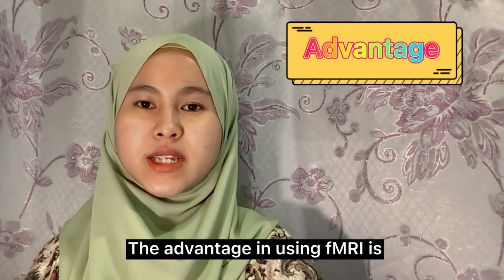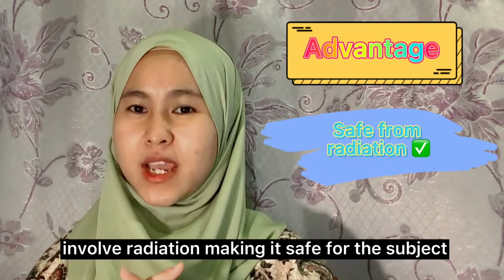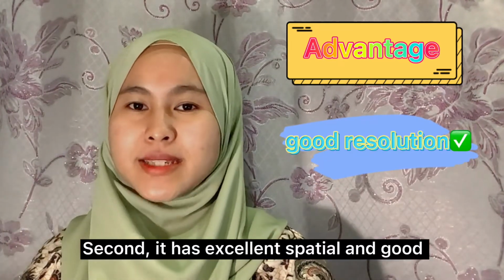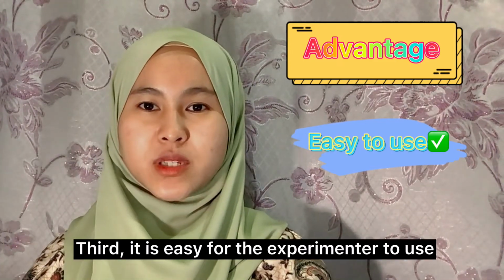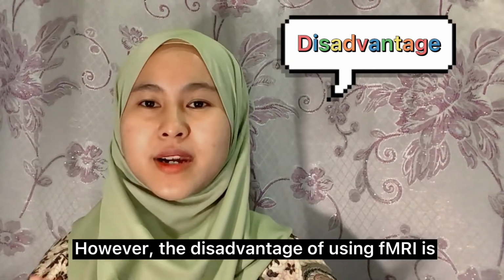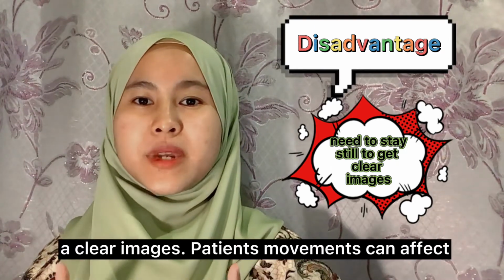The advantage in using fMRI is, first, it is non-invasive and doesn't involve radiation, making it safe for the subject. Second, it has excellent spatial and good temporal resolution. Third, it is easy for the experimenter to use. However, the disadvantage of using fMRI is the patient has to stay still to capture a clear image. Patient movement can affect the quality of the image.